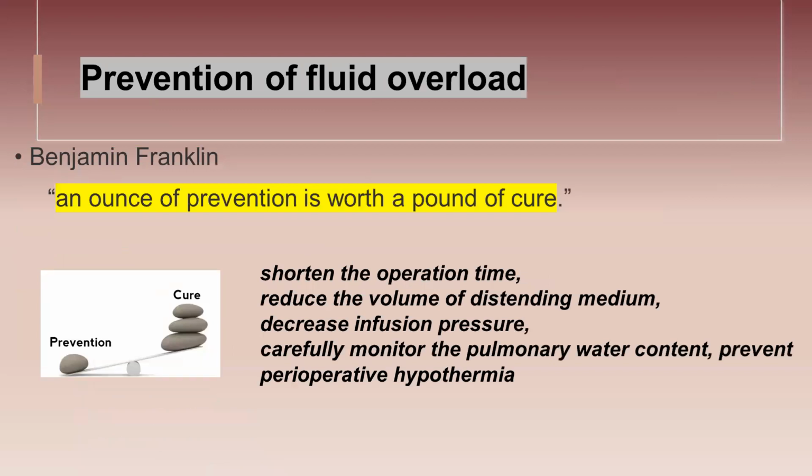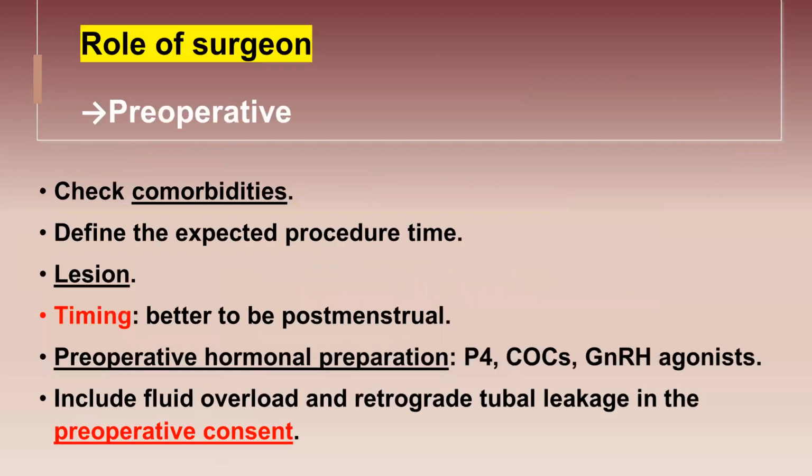So from this part of the lecture, we learned that the distension media are not ideal. Every type has its unique disadvantages. So we have to prevent fluid overload to prevent complications of these distension media. And this can be achieved by preoperative and intraoperative steps.